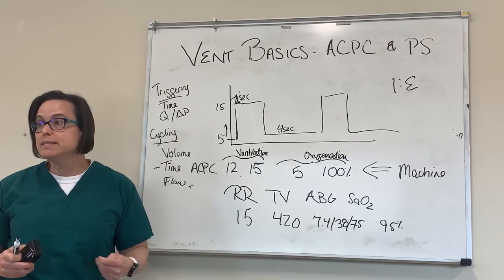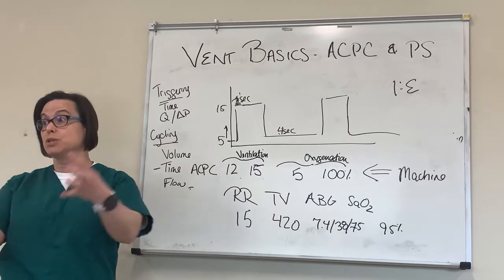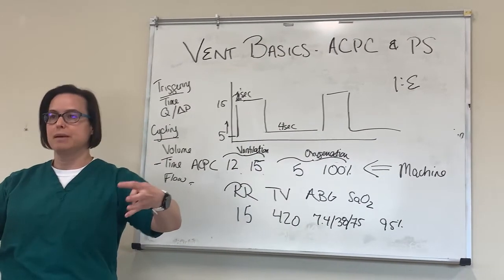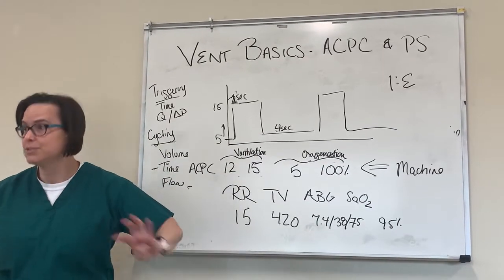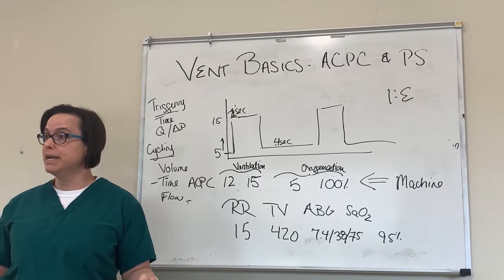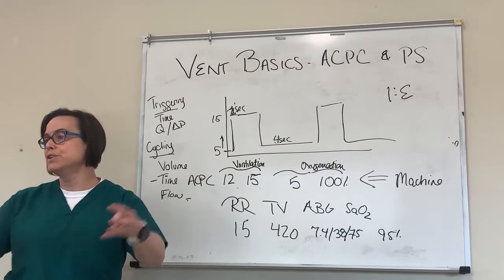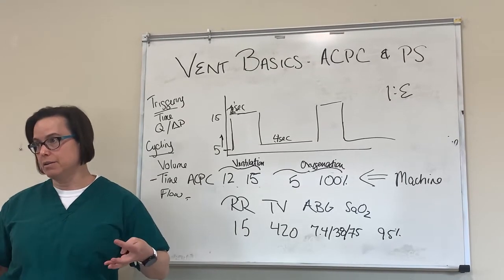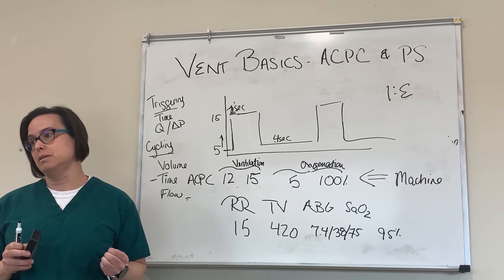Okay, the reason that this is going to be really helpful is if we have to hook all these patients up to one ventilator, I'm saying probably about 4 is the max we would do. We don't want to do that. There's a lot of reasons why we don't want to do that, but if it's a last ditch effort, we might. But if we set it at a tidal volume, we wouldn't know which patients are getting that tidal volume. If we set it to pressure, then that's easier for us to understand.